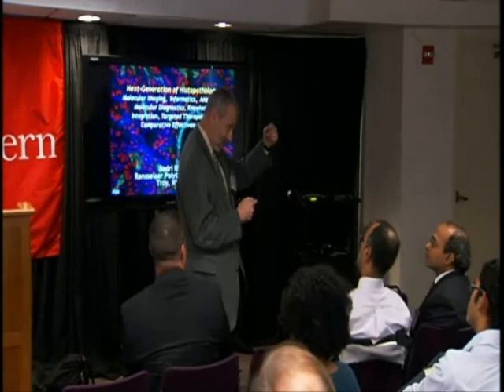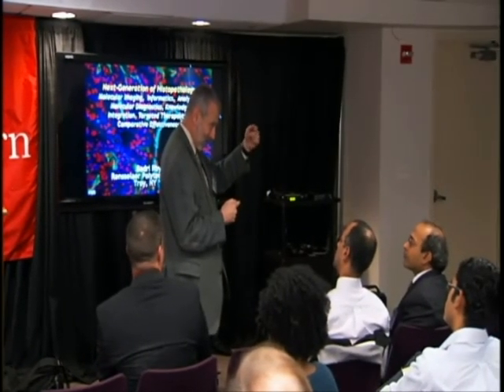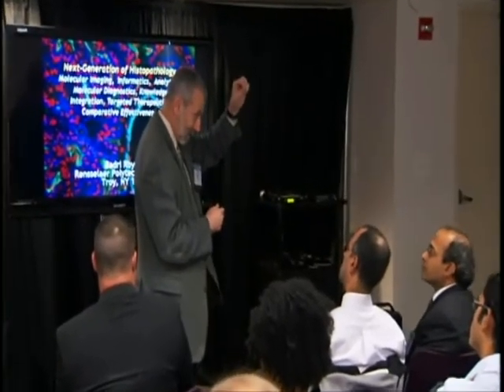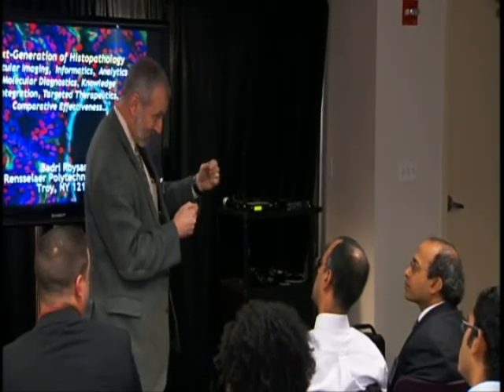The first photon excites a state appropriate to its wavelength. Maybe there's a little bit of decay there, and then the second one comes in and excites the next state, and then the third one comes in. They're actually real states. So instead of having a femtosecond to get the next photon in, you have a nanosecond. If you just look at the numbers, it says a 10 to the 18th improvement. It's not really that good, but you do get a great improvement.